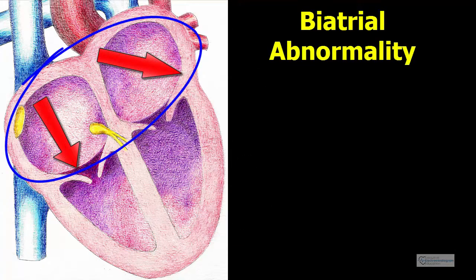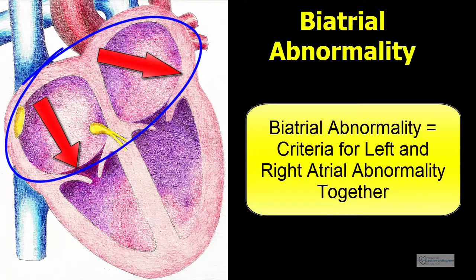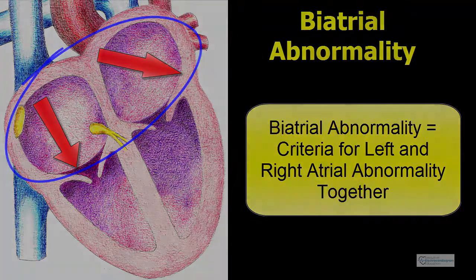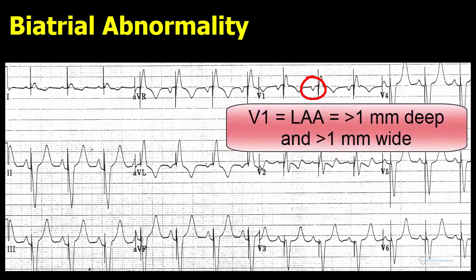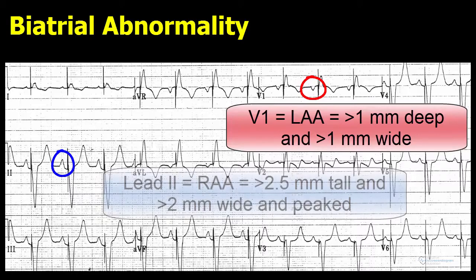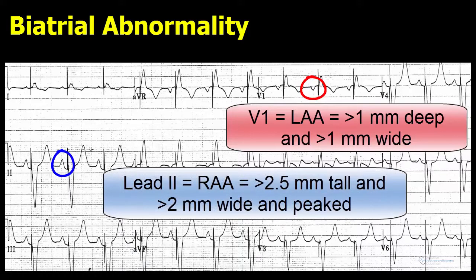Biatrial abnormality is simply both criteria for left atrial abnormality and the criteria for right atrial abnormality on the same electrocardiogram. In this ECG, we can see an inverted P wave in lead V1 that is more than one box deep and one box wide, suggesting left atrial abnormality. And the P wave in lead 2 is 2.5 boxes tall, 2 boxes wide, and is peaked, suggesting right atrial abnormality.